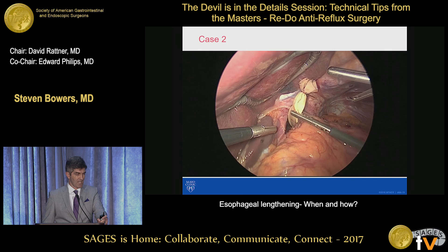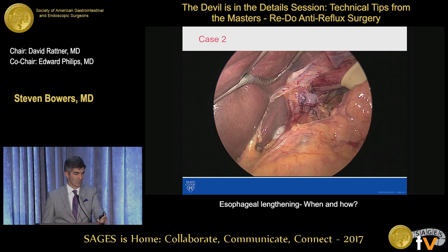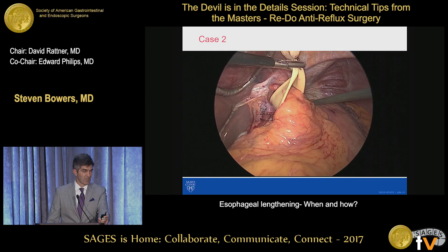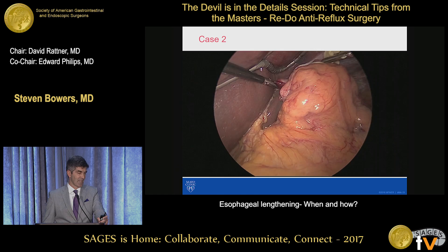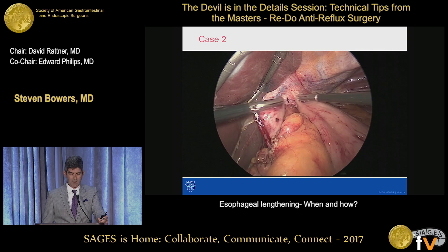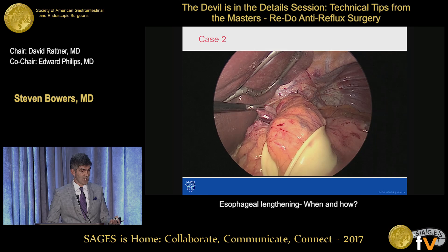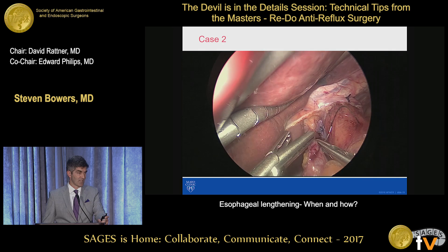And so once you have that, and you see that there's that lateral staple line on the gastrocardia, then I'm going to do my crus closure, and then I'll do a fundoplication based on the patient's preoperative assessment of motility. I'll take that same 50 bougie, back it up, and then pass it again to do my fundoplication. So here's the fundoplication — I like to see that the staple line is inferiorly on that patient's right side of the wrap. That corner of the staple line defines where my inferior stitch will be on the fundoplication. Then I do a shoeshine technique, and then the fundoplication as standard technique. But again, that upper stitch of the fundoplication has to include the true esophagus — you have to mark that visually and know where it is so that your staple line is fully covered, and you don't get dilation of that tubularized cardia segment.